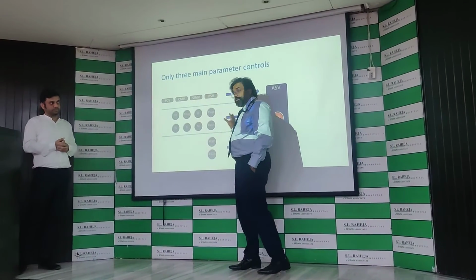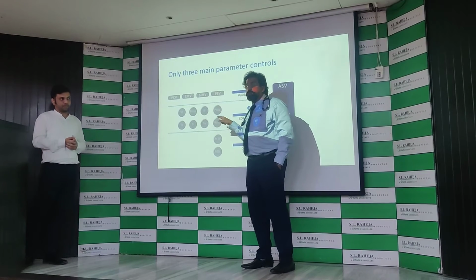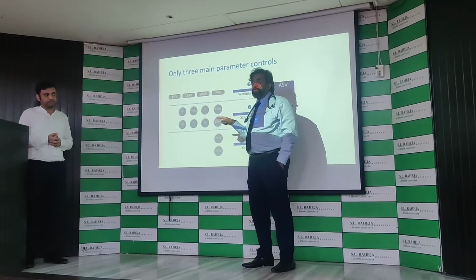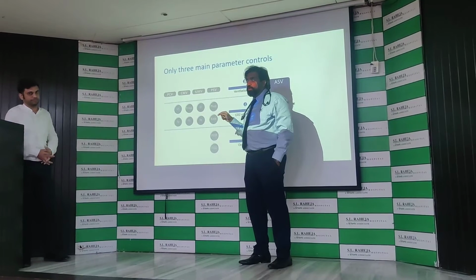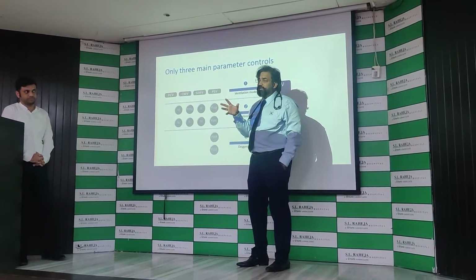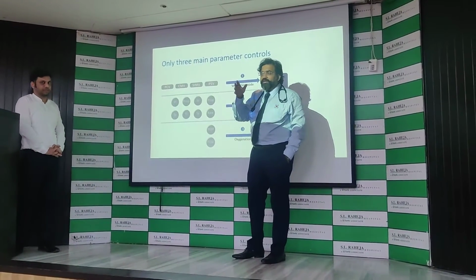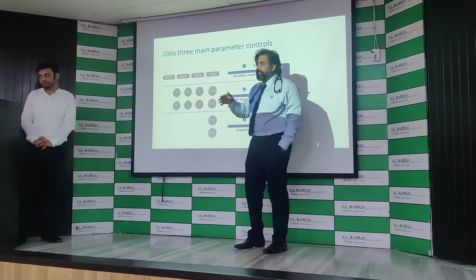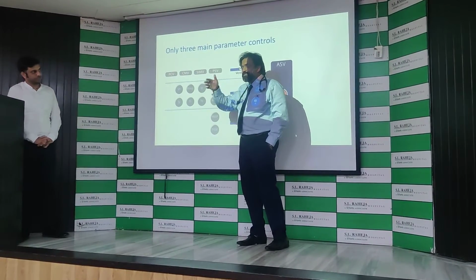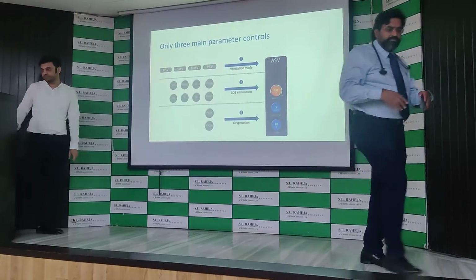Here, this is done on a continuous basis, so you don't have to keep setting it. If you are not setting your ventilator and not touching it again and again throughout your duty, you are not doing anything. It cannot be that your patient is a box. It's a lung. It's not going to remain the same. As you are treating, the patient is going to change, and as the patient changes, your settings have to change. If it remains the same and you are not touching it, you are not doing anything. You understand? Okay.